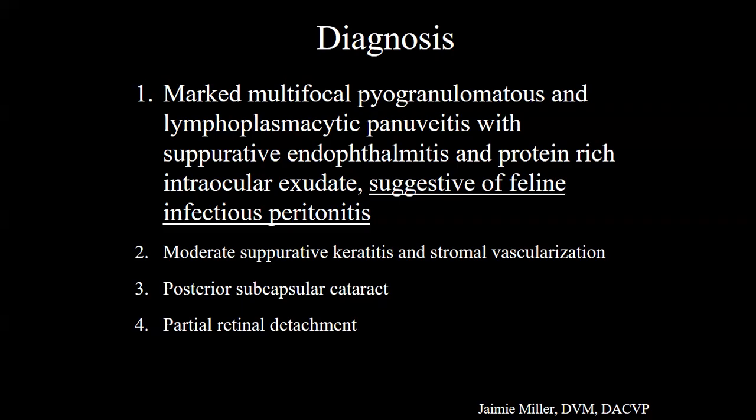There was not a lot of antigen deposition in the eye itself. They were not only in macrophages, but macrophages free floating in the chambers. There was almost no positivity in the uveal tissues or other tissues in the eye. That might explain why we're not seeing the vasculitis, but it's an interesting presentation in the eye.